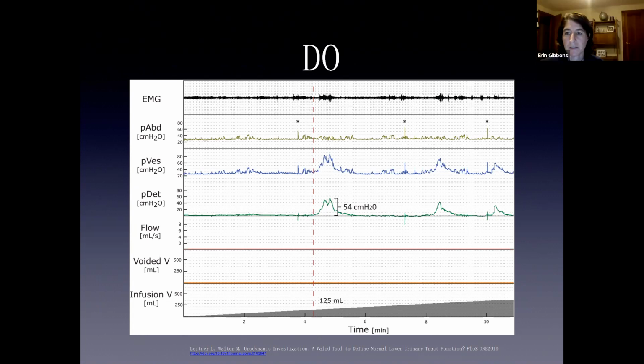I think one of the nice things about urodynamics is, unlike some other fields of urology, there's not a ton that's changing. An uninhibited contraction of the detrusor muscle is still an uninhibited contraction. Neurologic conditions and how they affect the bladder are still the same. So having the information from other lectures, today, and other articles, and then when you have a machine, you don't need the newest and greatest machine, or the newest article, because the tracing is still the same, and it has been the same for many years.